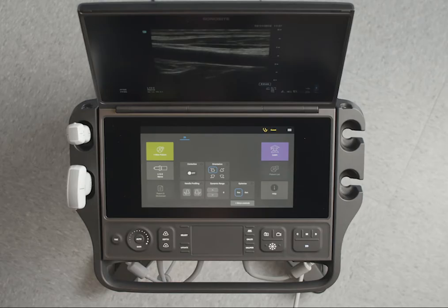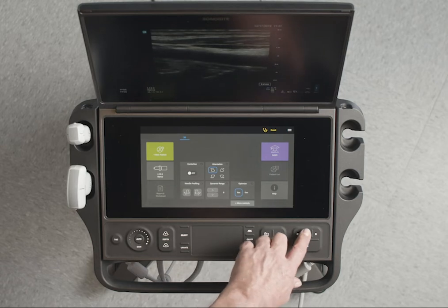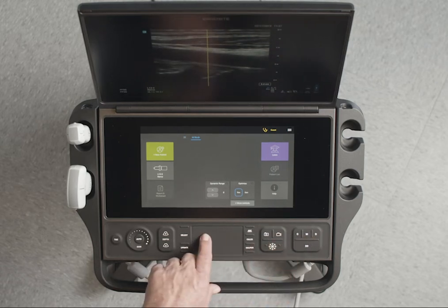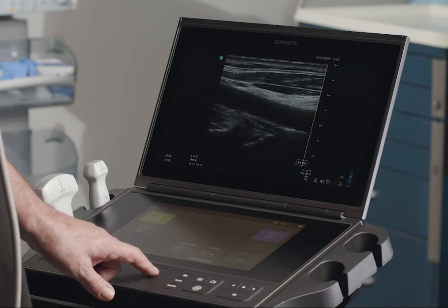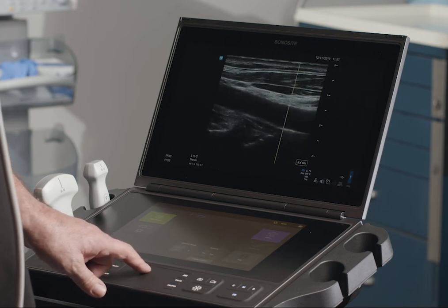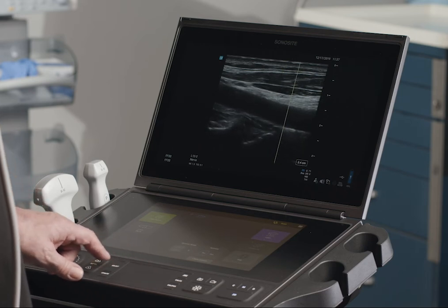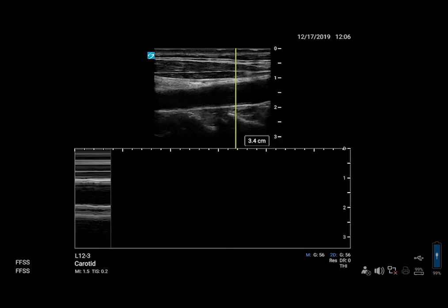Now let's change to M Mode, which provides a trace of the 2D image displayed over time. Slide the M line to the desired spot on the screen with the touchpad, and then press the Update Control to activate.